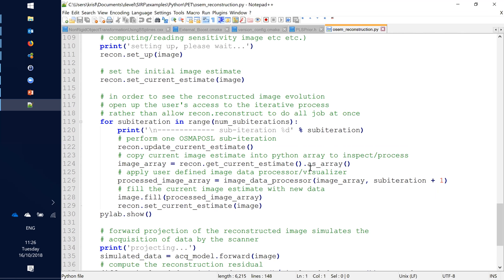Yeah. So you choose the distance. The data fidelity terms can be Poisson likelihood or least squares. At the moment, the only thing that's implemented here is the Poisson likelihood. Okay, that's what's implemented. And then when you call your specific algorithm, you just check if it's compatible with the type of likelihood.